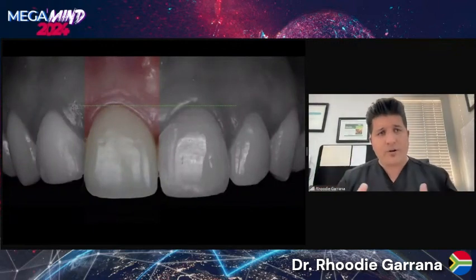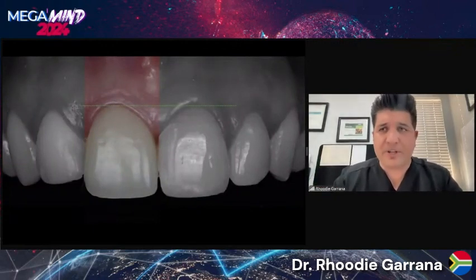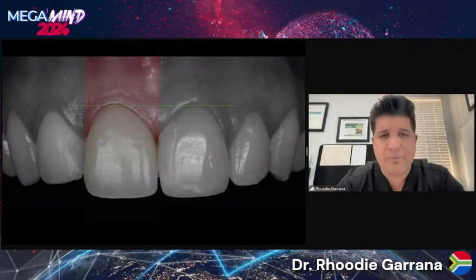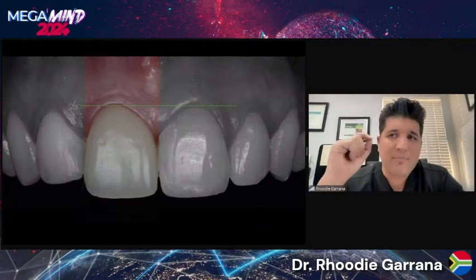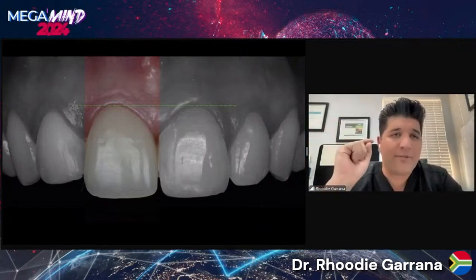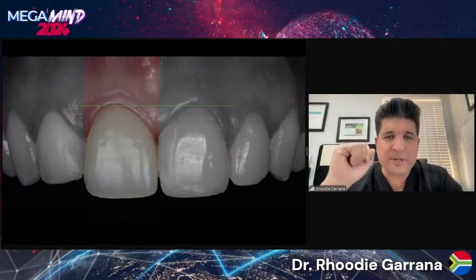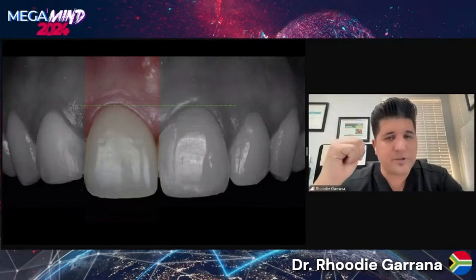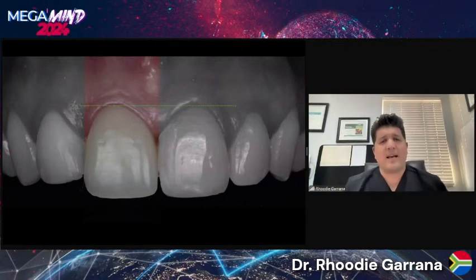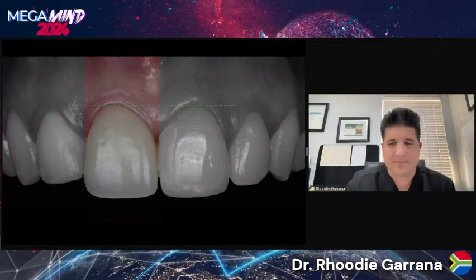We can see that there's been a coronal creep of the soft tissue, and this is very thin soft tissue, but we can see that there's been a coronal creep of this tissue. Why? Primarily because we have volume, we have bone, and we have followed the principles of ideal prosthetic crown contours. So we can control where we want the soft tissue to be. So we're very pleased that at 4 months, we've seen an optimal healing in this case.